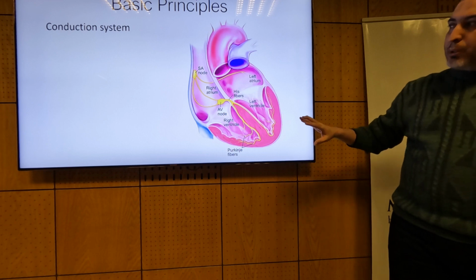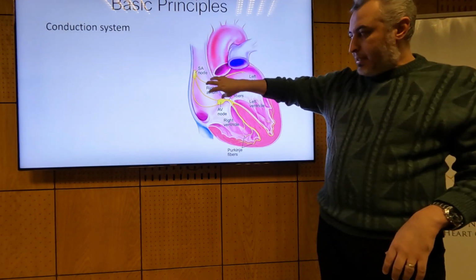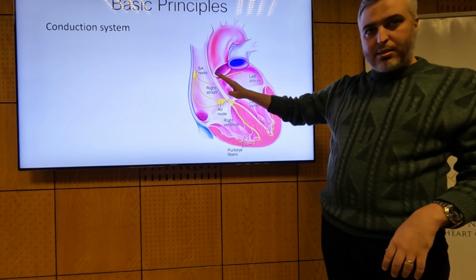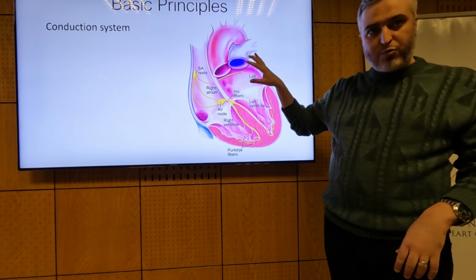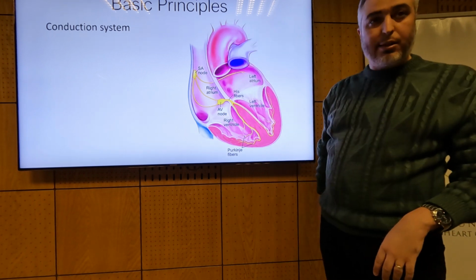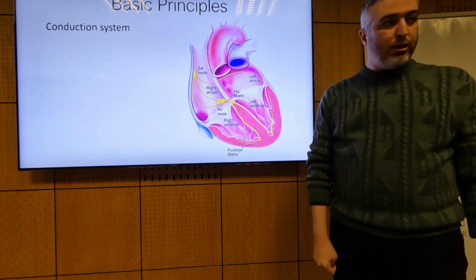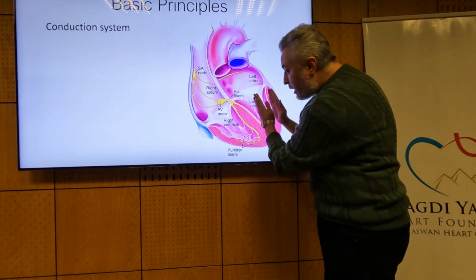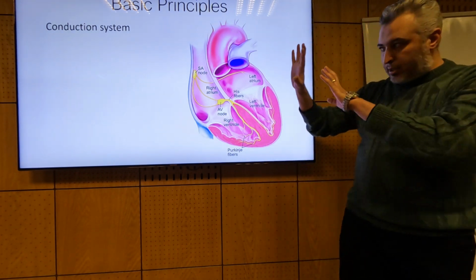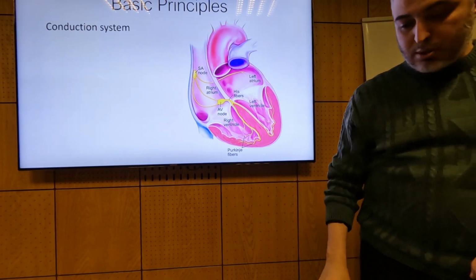So now we have talked about synchrony between the atrium and the ventricle with an AV delay, and we know that this does increase cardiac output, improves the ventricular filling. So AV synchrony, interventricular synchrony, and intraventricular synchrony. Okay? And that's why this configuration is very efficient to reach these goals.